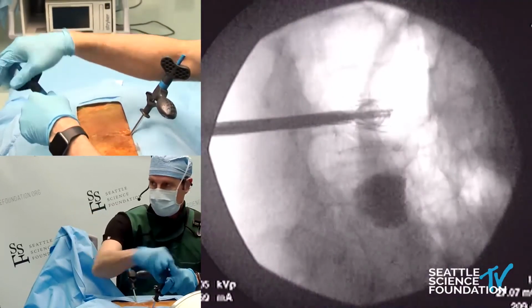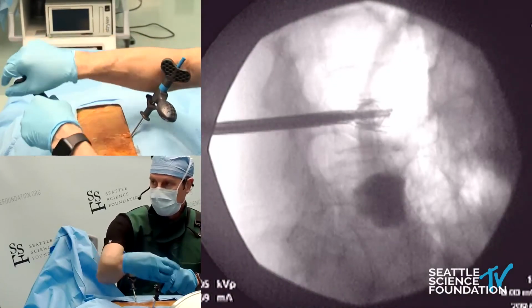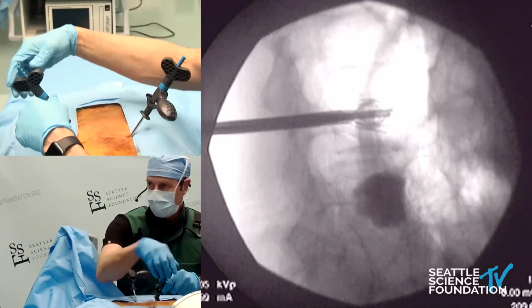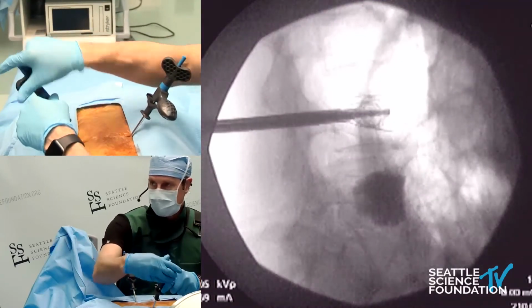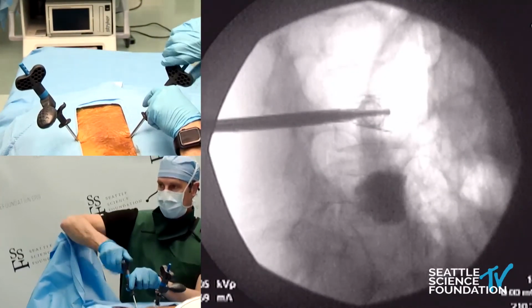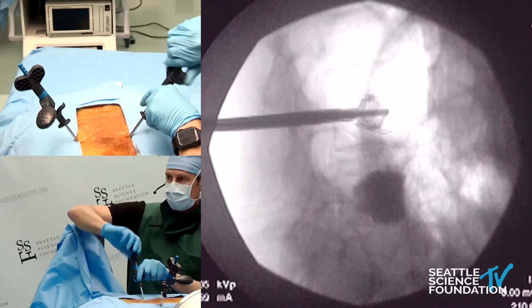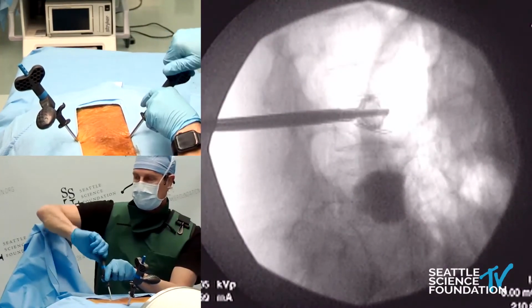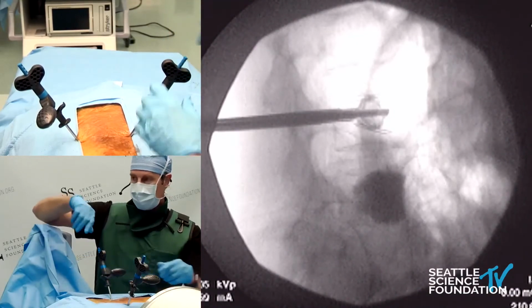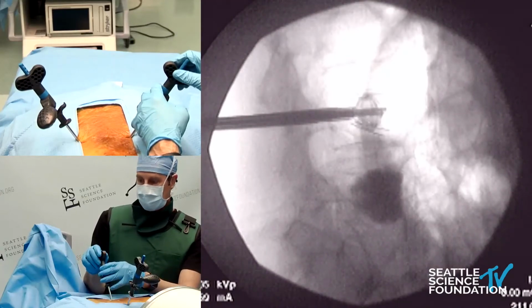Nice. And this is 13 turns of the butterfly handle. Regan, in case you're wondering that, you probably already knew that. 13 turns. We actually counted one day just to see. And we'll fully deploy. I fully deploy these the vast majority of times. I want to get maximum reduction. Unlike the jack in the trunk of your car, it doesn't push off the ground, it pushes off the central post, it goes up and down. And so this is full deployment.